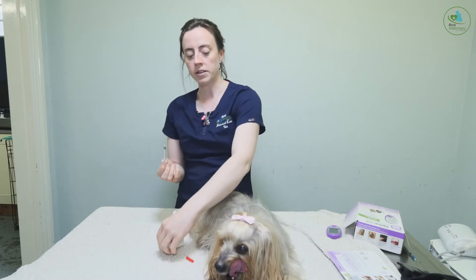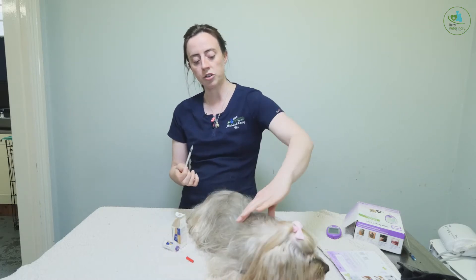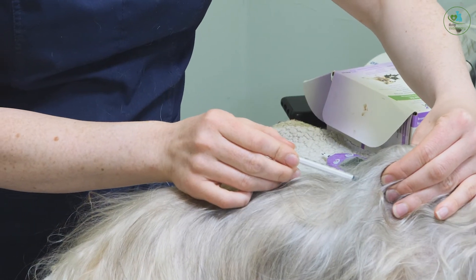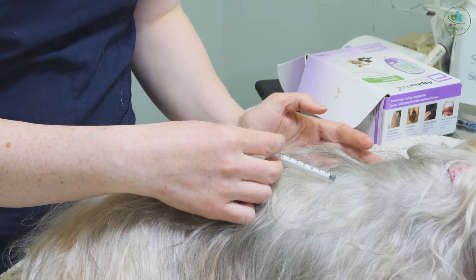The area that I recommend injecting in the dog is around here on their scruff. Pick their skin up really nice and gently, in with the needle — she doesn't even notice. Drop the skin and then inject.